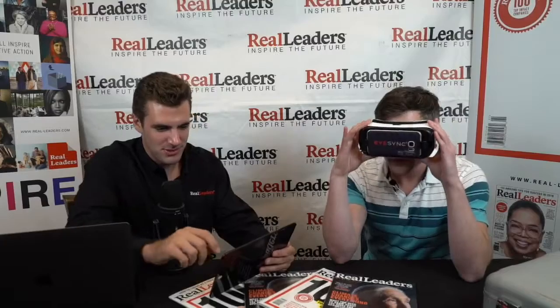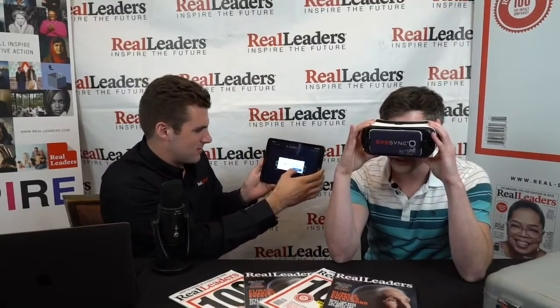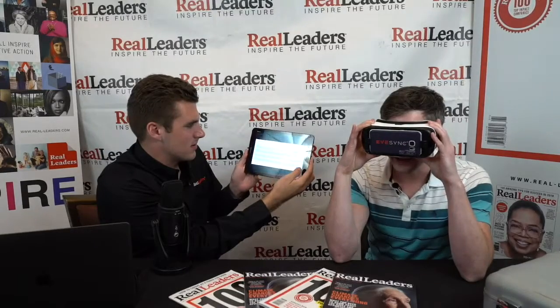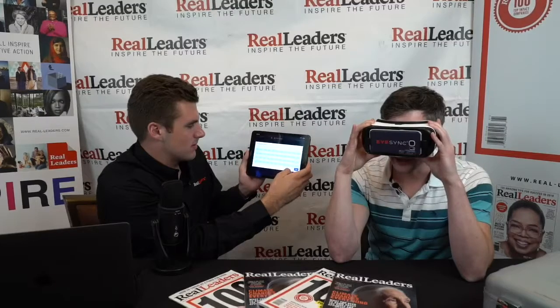Okay, well, let's get to it. Put on the goggles, Daniel. Let's do the smooth pursuit. Yep. So here, we're testing four modalities of orientation. So either I'm moving or the world is moving, and I'm synchronizing my eye movement to the visual stimuli. And that allows me to synchronize my behavior to interact in real time with the outside world.